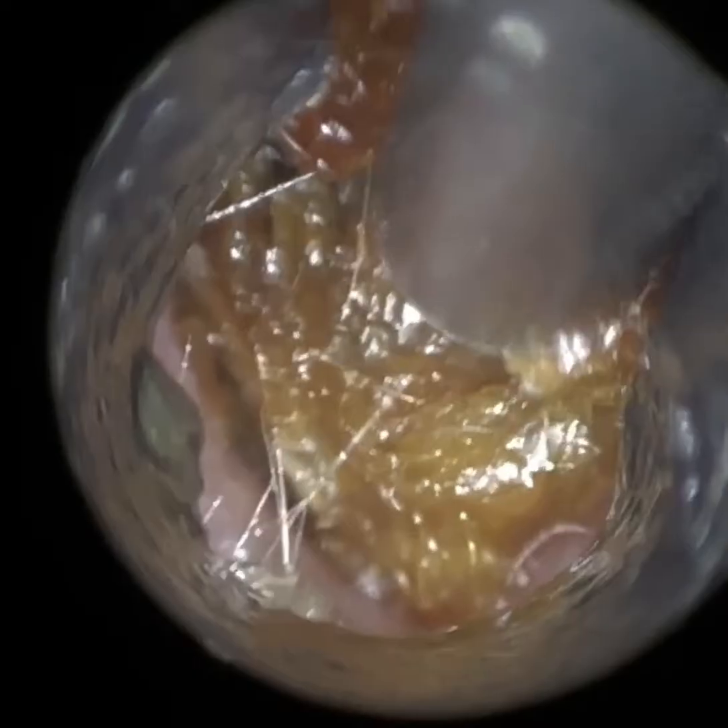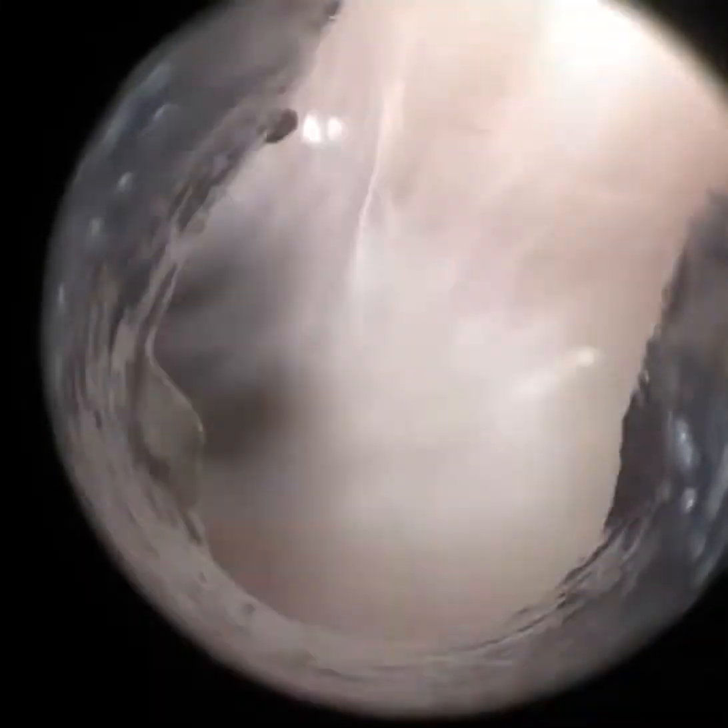Sometimes with a hook you're using it in combination with the instruments — you're not necessarily always extracting the wax, you're just chiseling it into little pieces to enable you to remove the rest. In this kind of case, you couldn't remove this solely using microsuction. That's why as a clinical ear care specialist you need to be competent in all instruments, not just the suction probe. I'm aware that some people are just using suction and haven't been trained using any of the instruments. It's very important that you need to be able to remove wax not solely relying upon microsuction — a case like this is a perfect example. When developing the Waxscope, it was developed in such a way that we're optimising the use of all instruments, not just microsuction.